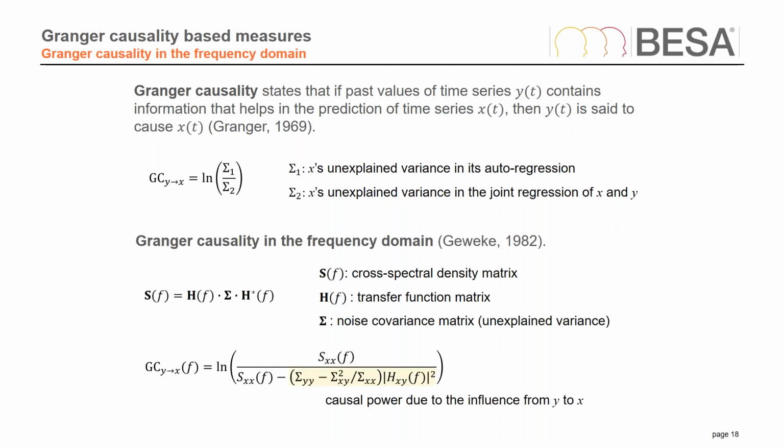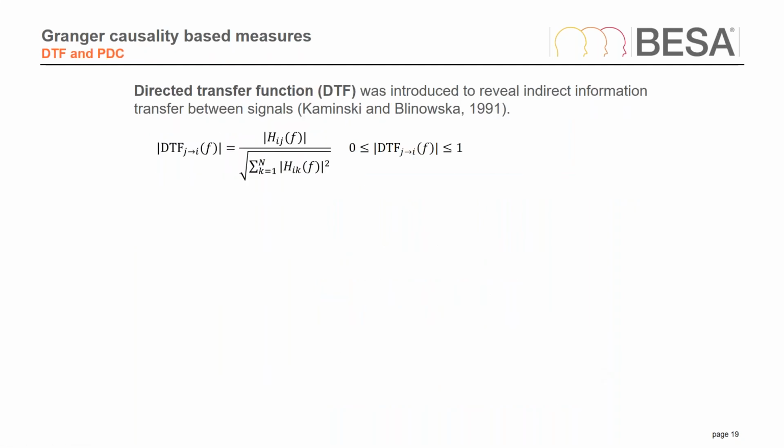So these are the formulas for the frequency domain. Now this gets a bit more complicated. I can maybe skip the explanation, but you can still see in the final formula the familiar cross-spectral density matrix S, XX in this case, which then gives us the self-spectrum here.